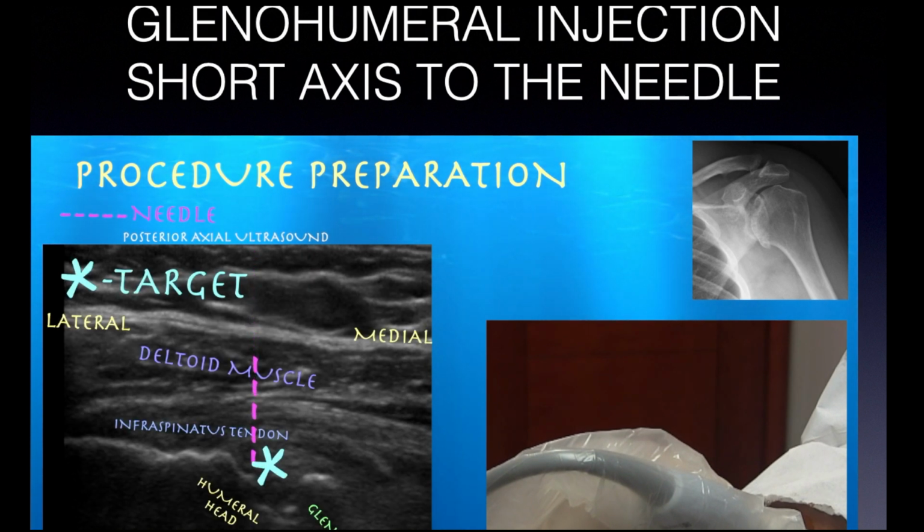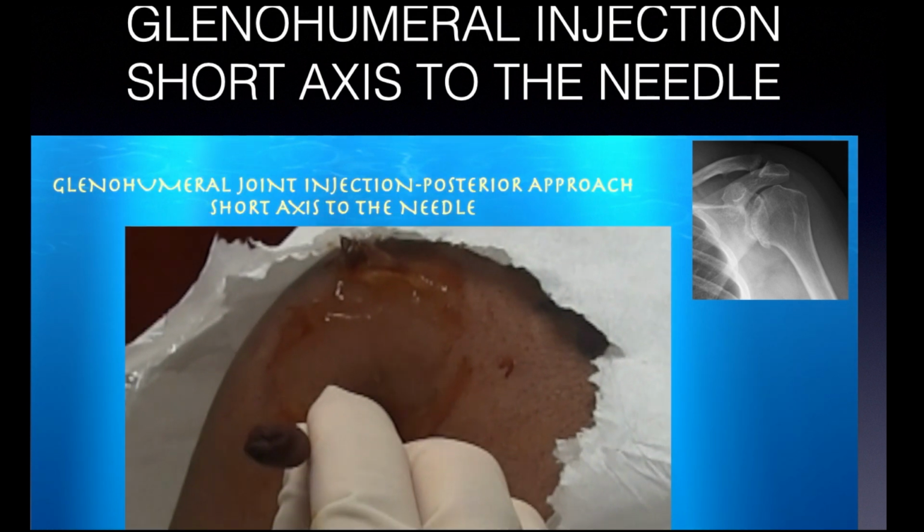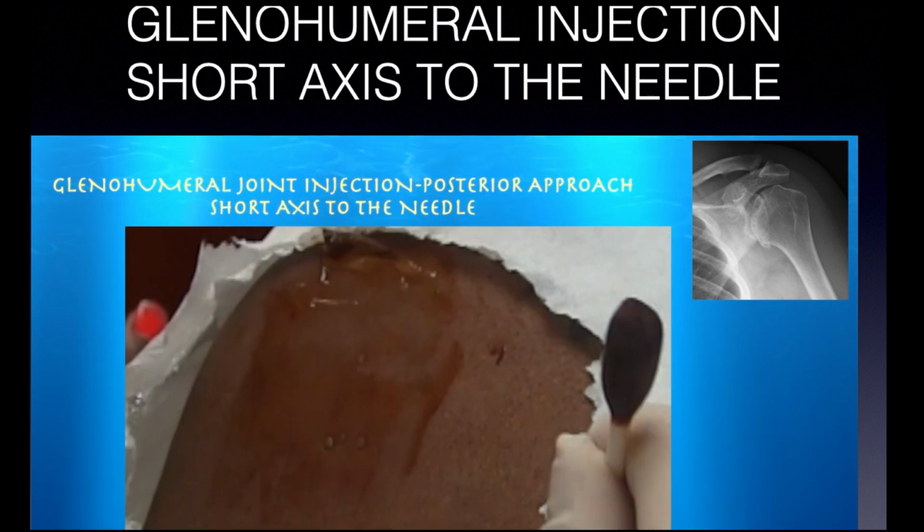And like any injection, I think your major work is before the injection, is prepping for the injection. You don't want to put the needle in and then try to figure things out. You almost want to visualize the actual procedure before you do it.